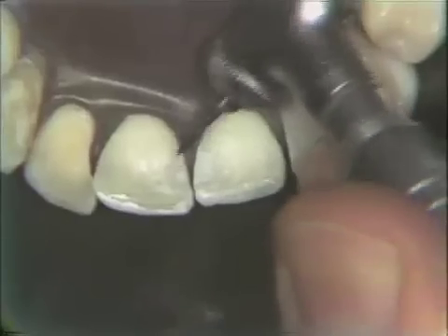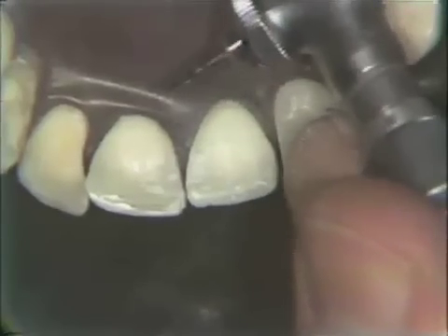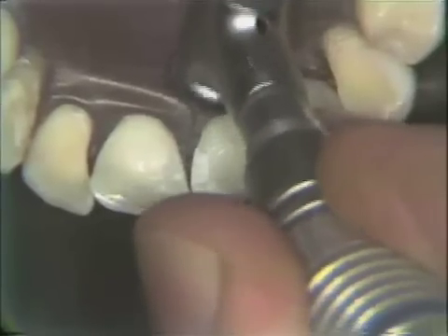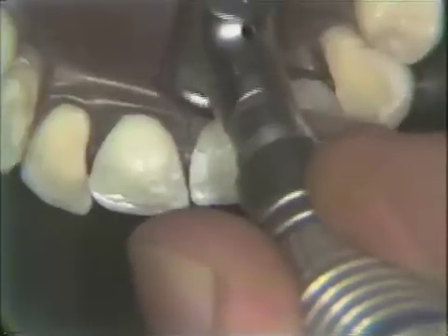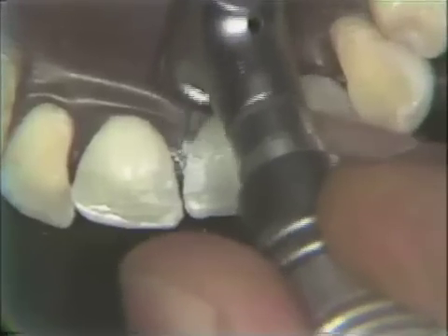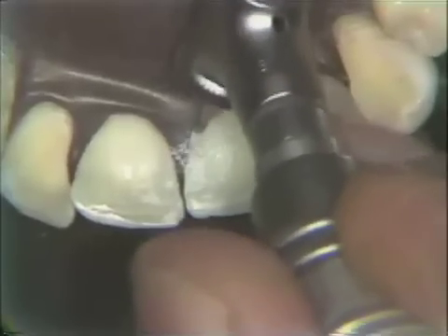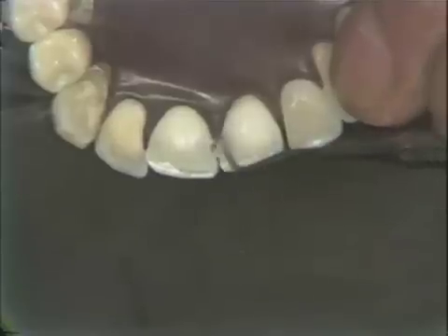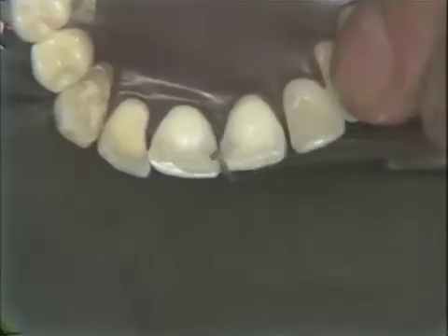Now the 7901 burr, it's a 12-bladed carbide burr, run in conventional speed and very light touch. Very light touch. You notice we're at the cervical now, being so careful not to touch the cervical enamel. The KY jelly is now placed over the restoration.